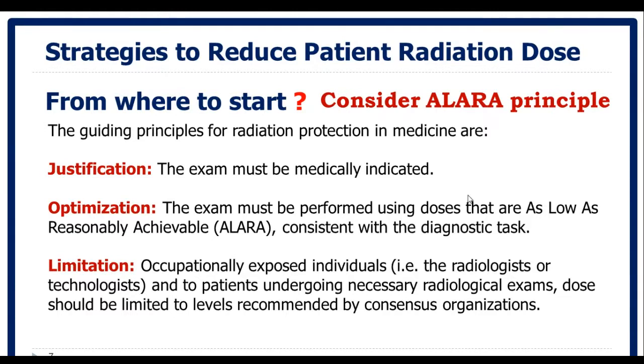Then after optimization, we need to review the current status of the procedure by monitoring and comparing the examination dose with appropriate benchmarking, such as diagnostic reference levels. Okay. And compare also the image quality with the appropriate benchmarks, such as the European guidelines for CT image quality.